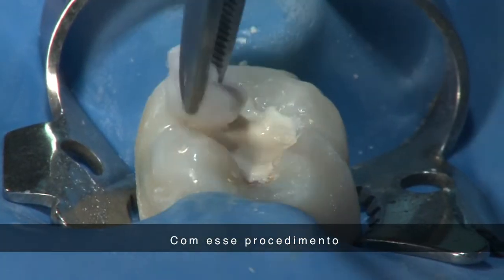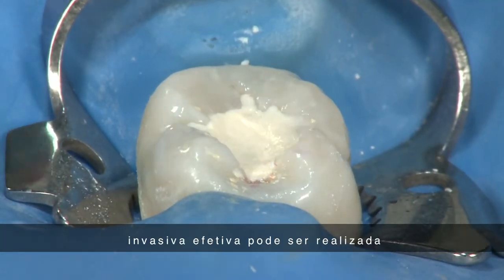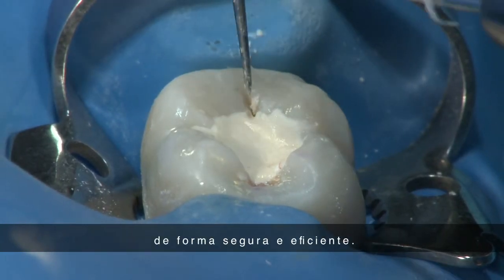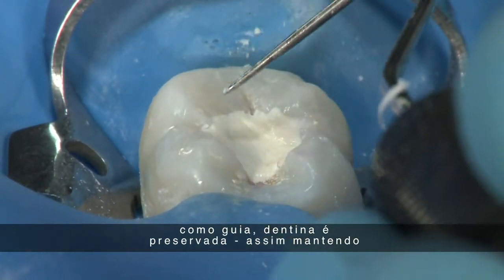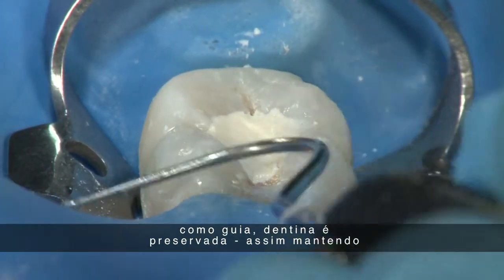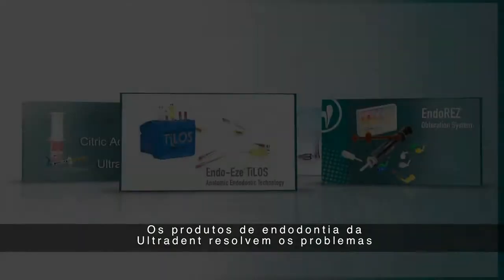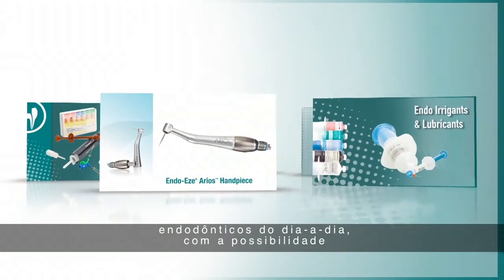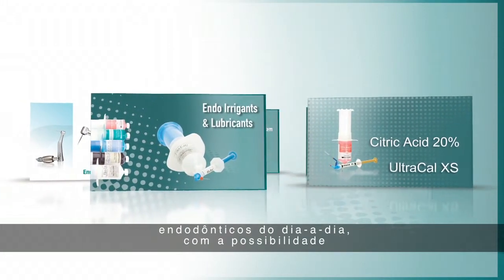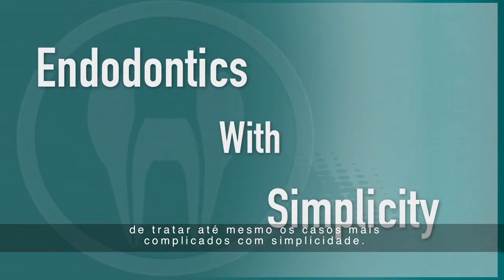Throughout this procedure, we've demonstrated how effective minimally invasive endodontics can be performed in a safe but efficient manner. By using the natural anatomy of the tooth as a guide, dentin is preserved, thus maintaining the strength of the natural tooth. Ultradent's endodontic products solve everyday endodontic problems, giving you the ability to treat most endodontic cases with simplicity.